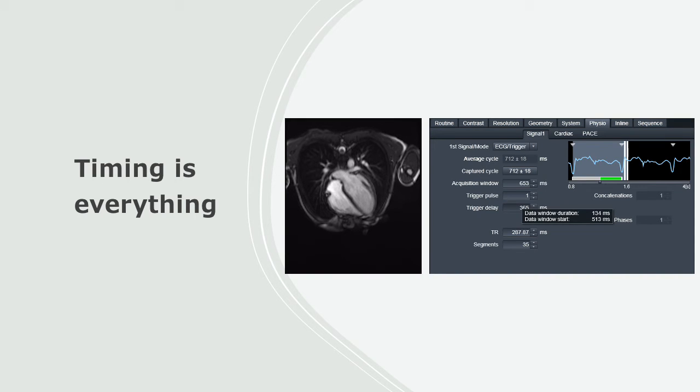Following on from 4-chamber views, we found that the setup for the correct acquisition window was the biggest challenge. From observation, we found that a few staff members found this confusing to do. However, from practice and discussion, we found this helped. From this, we were able to discuss what parameters and what numbers were needed from the 4-chamber view to identify quiet periods of the heart, and what parameters were needed to put into the scanner to finalise the acquisition window. But as you can imagine, in reality, when time is running out and the patient doesn't want to lie on the table, it's difficult to do these calculations.